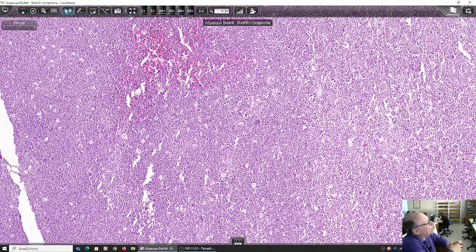However, since these cells derive from germinal centers, there are two immunomarkers that are expected to be expressed, in addition to CD19 and CD20, and the light chain restriction under condition that they have surface immunoglobulin, as we previously said.